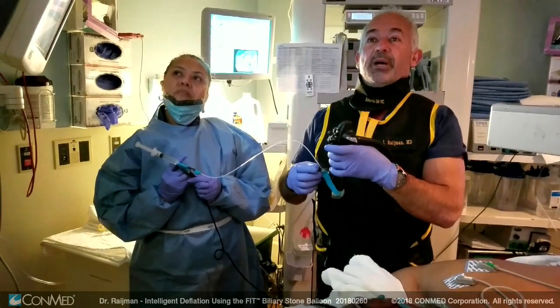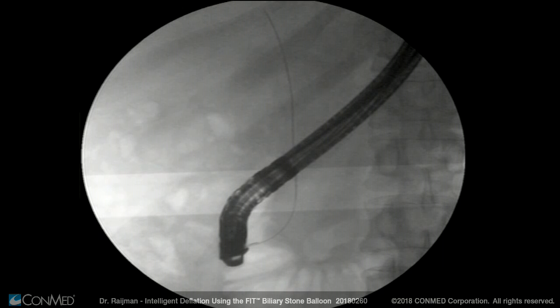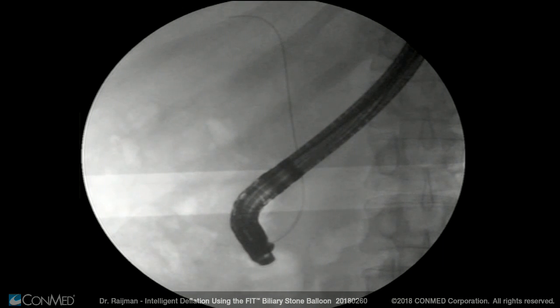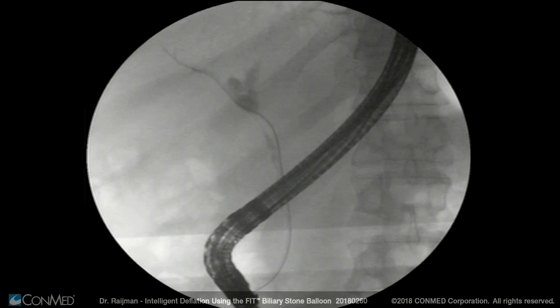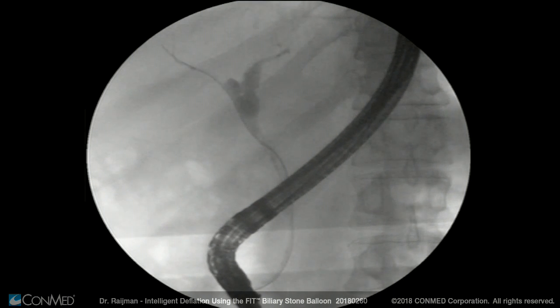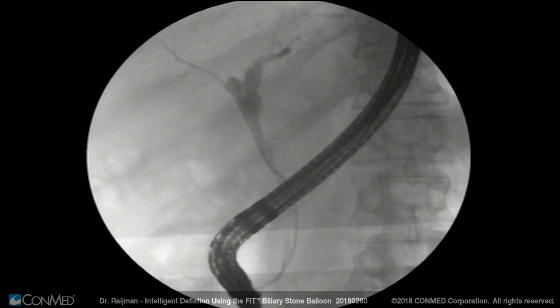On fluoroscopy, the tip of the wire is positioned well above the expected site of the anastomosis. You can see that the biliary tree in that area is mildly dilated, and it is tapering toward the anastomosis, which is right there at the tip of the wire.